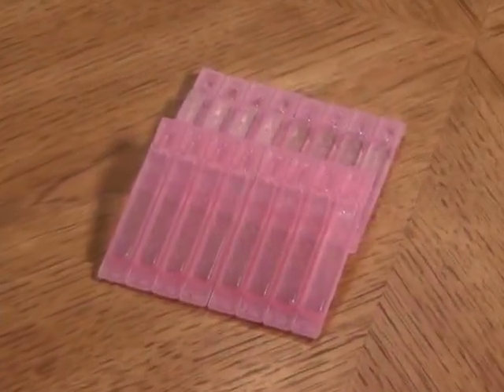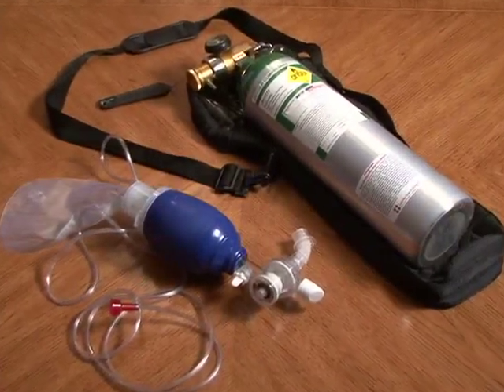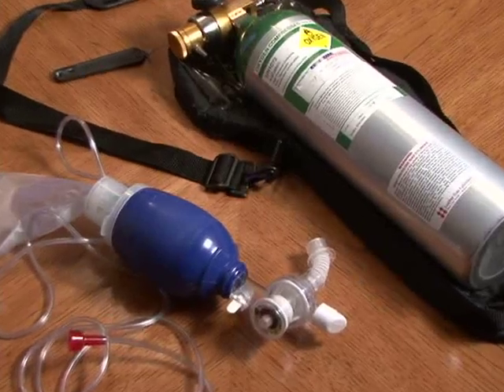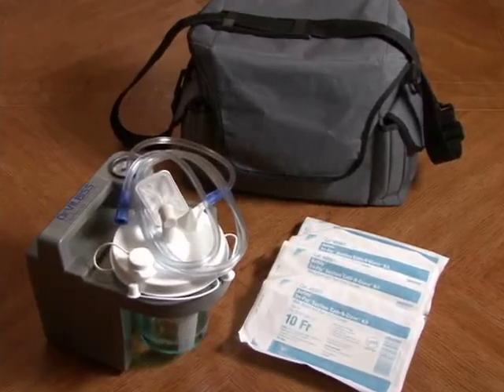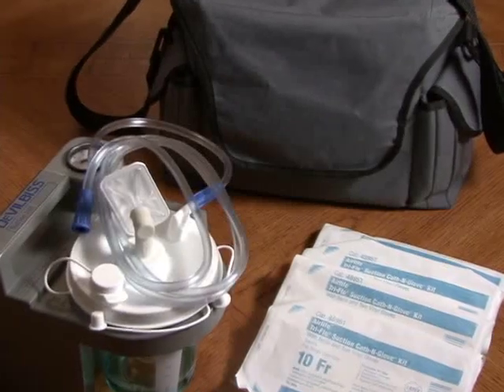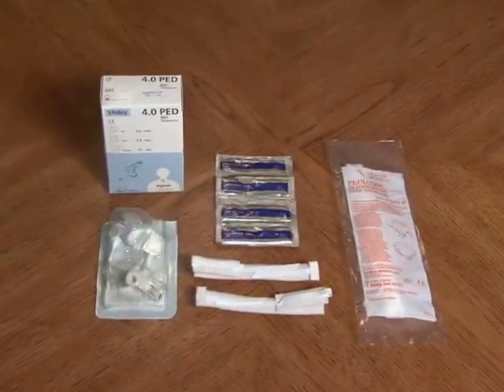Sterile saline bullets. Ambu bag and oxygen should be within reach for emergencies, or if your child needs oxygen as part of the instructions given by your doctor. Suction machines — stationary or mobile. If you can get one of both, it will be helpful to use the mobile suction machine in another area of the home. Extra trach, trach ties, and lubricant in case of emergency.